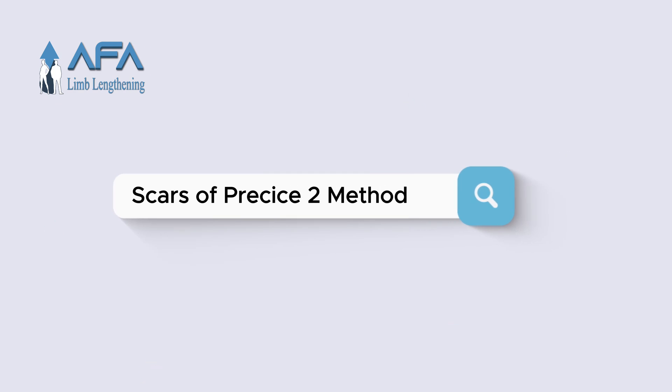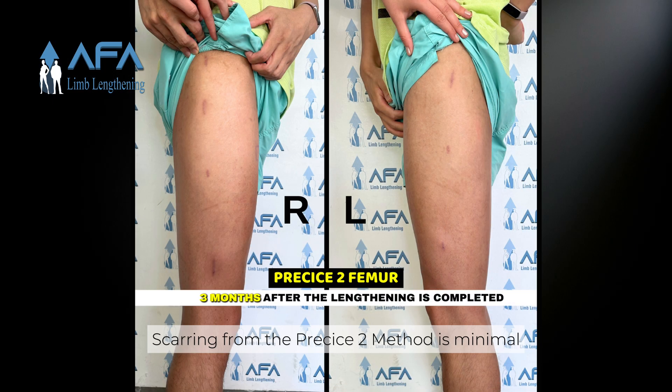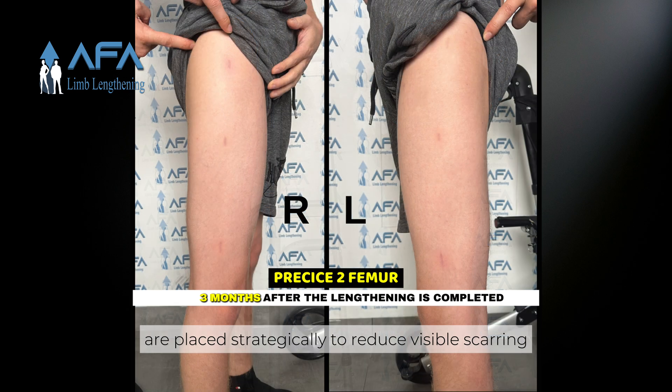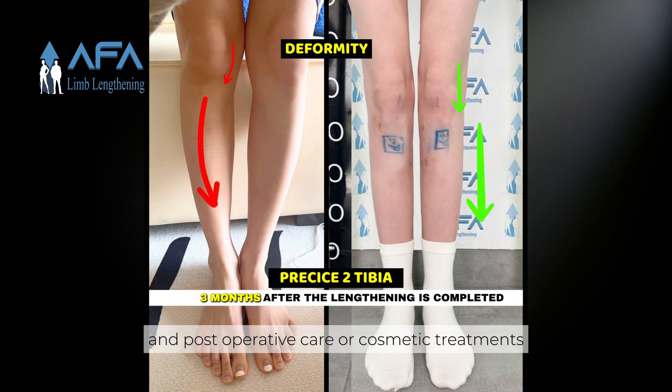Scarring from the PRECISE2 method is minimal. The small incisions made to insert the nail are placed strategically to reduce visible scarring. Over time, these scars tend to fade, and post-operative care or cosmetic treatments can further improve their appearance.